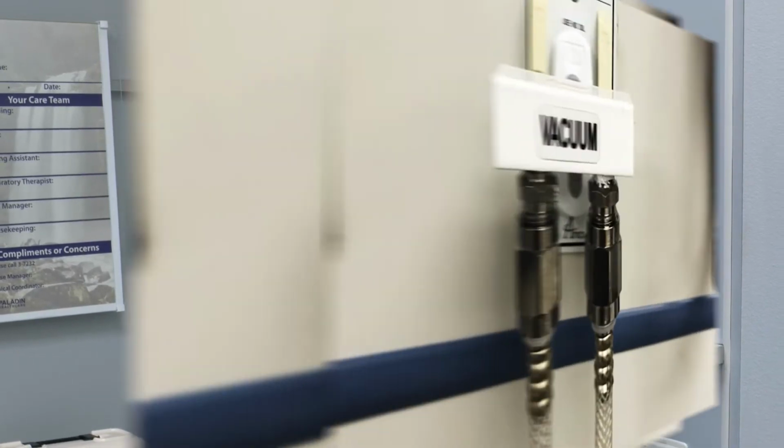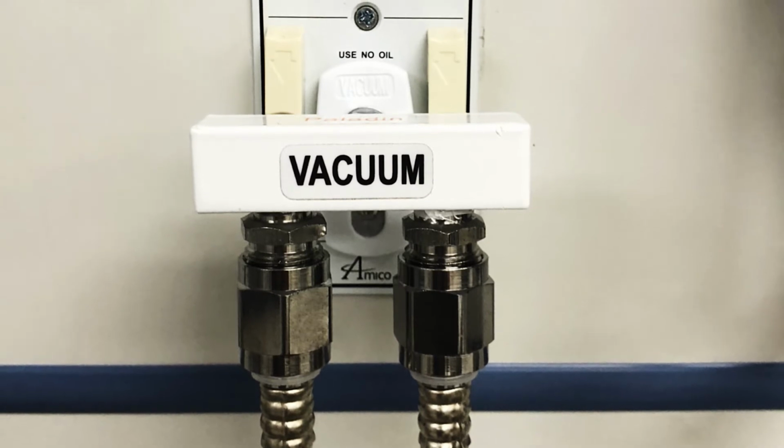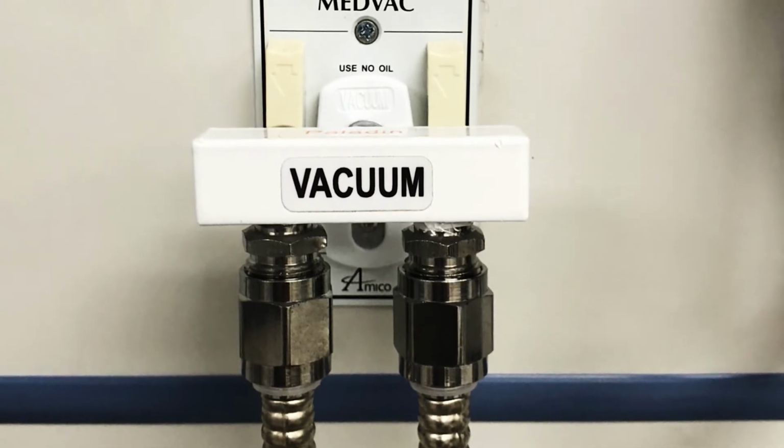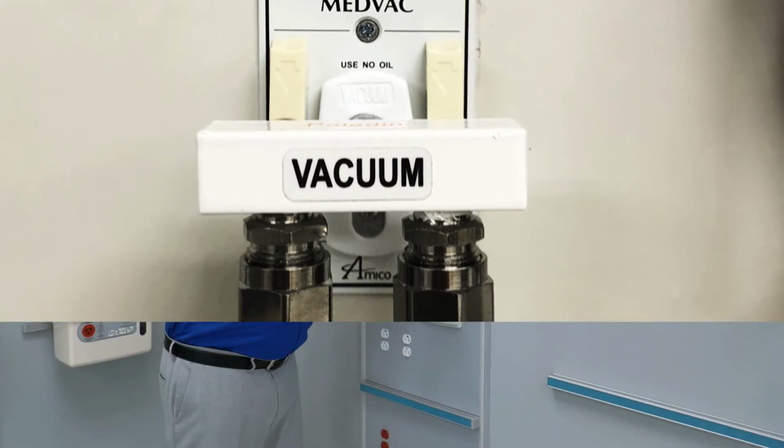So one of the other challenges is how do we expand vacuum under a surge condition. We don't do it the same way as we do oxygen because it's very difficult to daisy chain those gas blocks because we lose the vacuum pressure. So what we do is we have something called the splitter block. The splitter block is something that goes directly into the wall outlet and is secured the same way. And by the way, this can be any flavor of gas outlet, DISS, Chemtron, Omeda, doesn't matter. And we have 2 discharges.